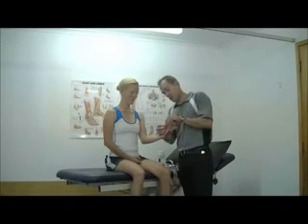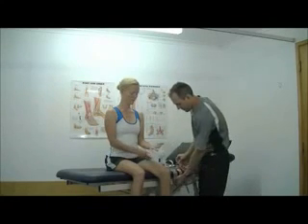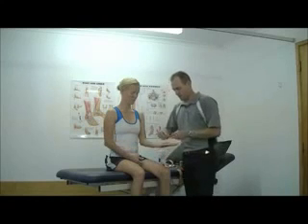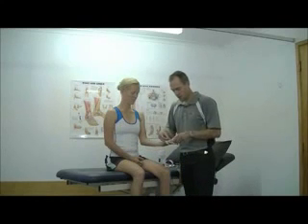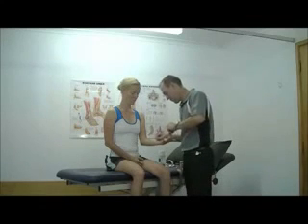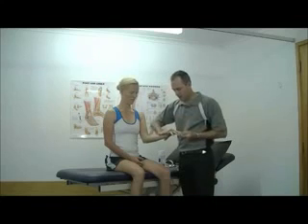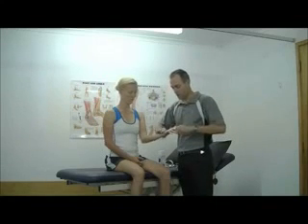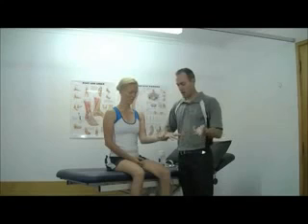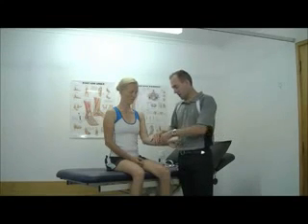I must emphasise this isn't how you use a kinesio, but I'm just trying to demonstrate the differences here. If we take a piece of dynamic tape, again, we stick it on in inner range with some strong stretch on it, what you'll find is we can still actually get all the way through the range of motion, and have a much stronger assistance, therefore, mechanically.